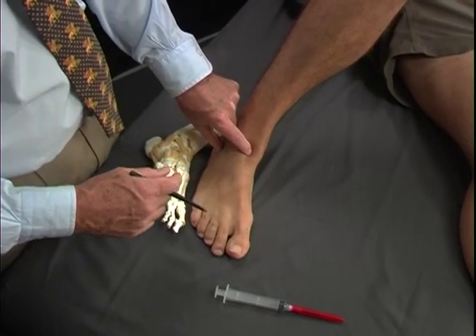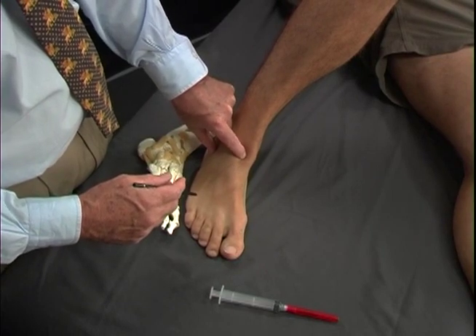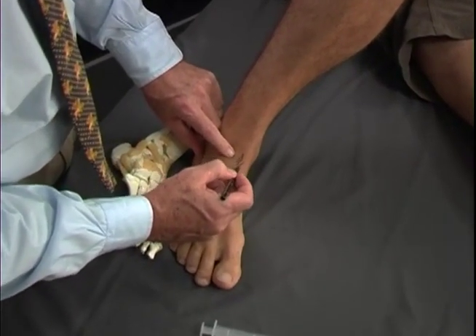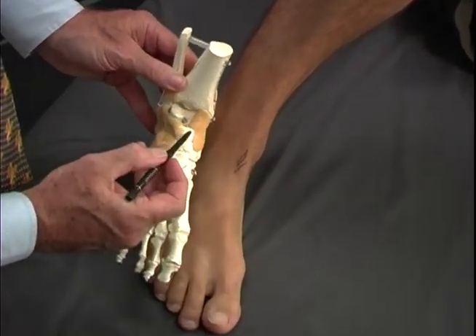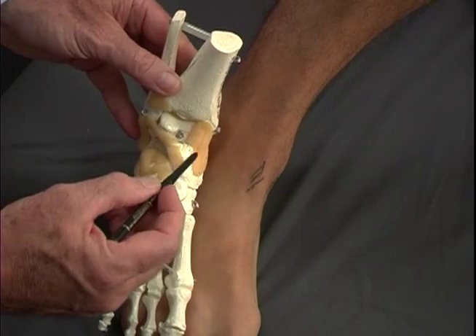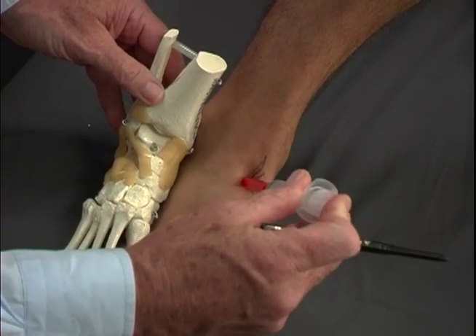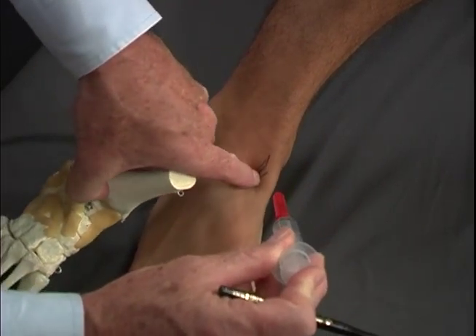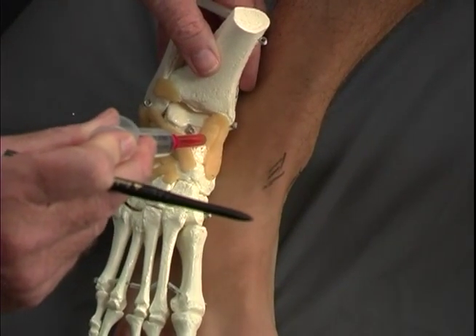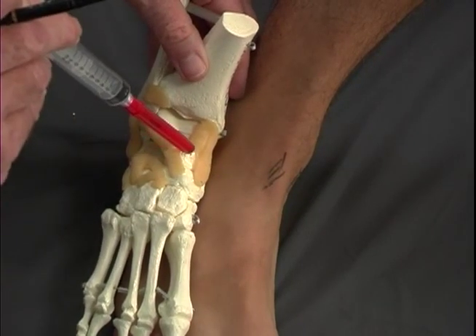We're now in the anterior part of the ankle, and we have the anterior tibio-talar ligament, the anterior part of it coming down like this. And when we look at our model, it's this portion of that tibio-talar ligament right here. And so we can come in with our needle directly onto the talus. Sometimes this is a very tender portion deep in near the talar dome, and we can see that injection in our model again with the tibio-talar portion of the deltoid ligament right here.